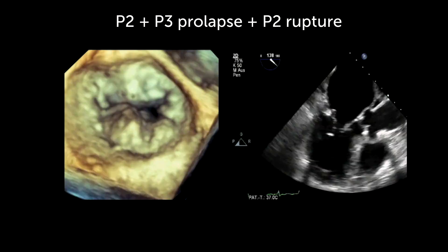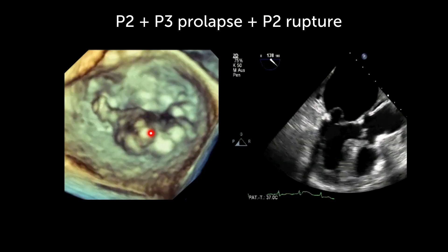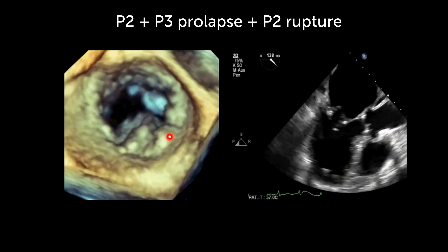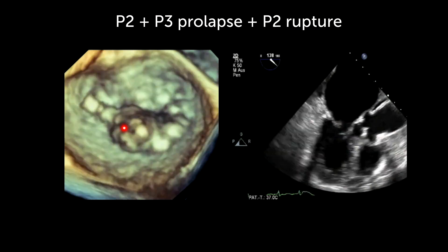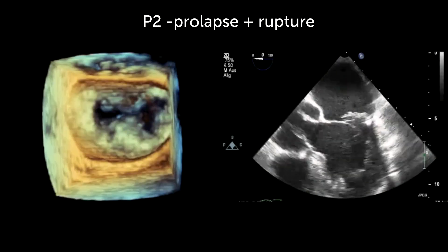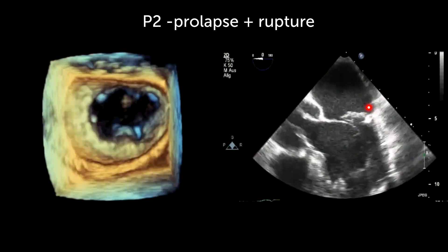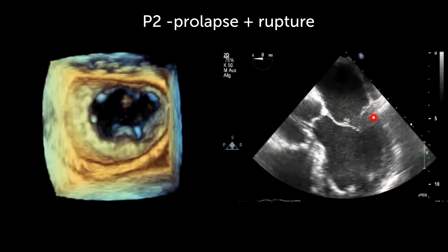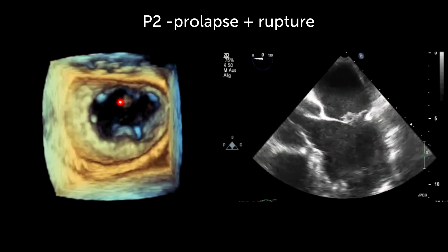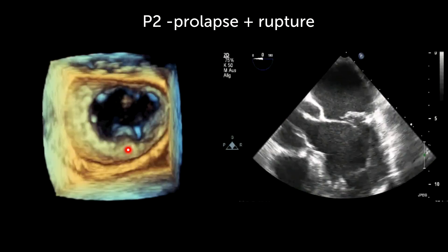In prolapse, we have a portion of the mitral valve which protrudes into the left atrium. It almost appears as if there is some kind of a hill or a mountain here which is looking towards you. Another example — it's clear to see that the posterior leaflet is flailed here, the leaflet is also thickened. And here is the flail part, right here in the middle of the posterior leaflet.